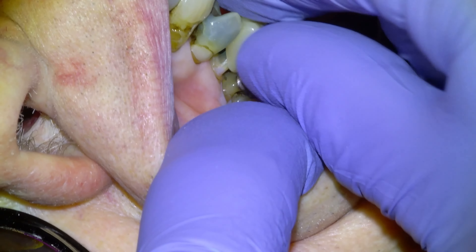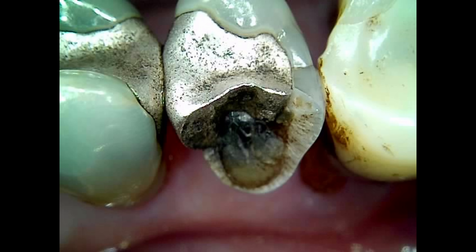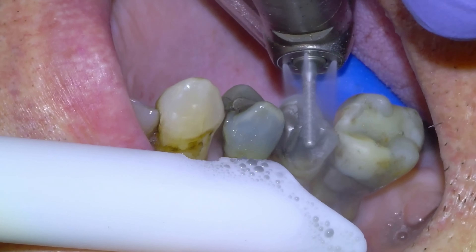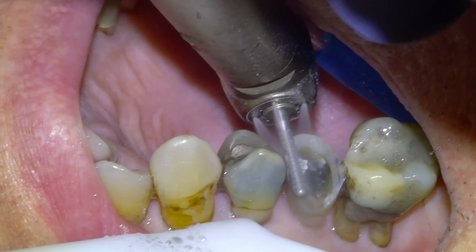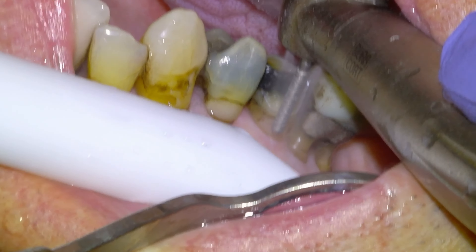Here's a photo of the tooth — it's an upper right second premolar 1.5 with an MO amalgam and a fractured buccal cusp. There's a bite on file; tooth tested vital. So we're going to give the patient options of either a large direct restoration with a poor prognosis, or a crown with a good prognosis. Patient wanted to do a crown.